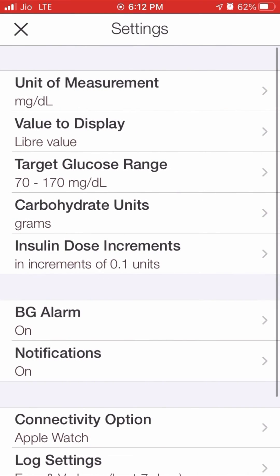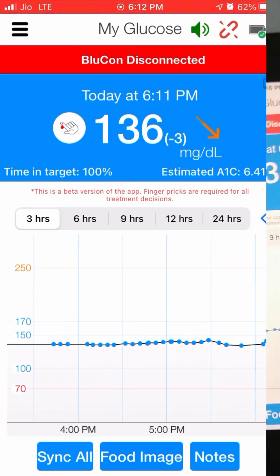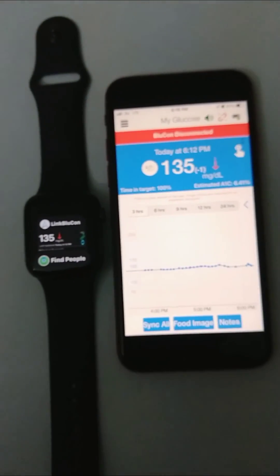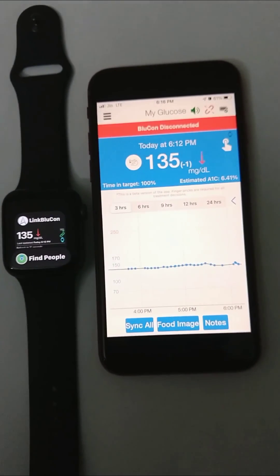You can see the Bluecon is disconnected from the phone and connected to the Apple Watch. It's updating the readings on the watch and will continue to update the readings on the phone if the phone is nearby the device.